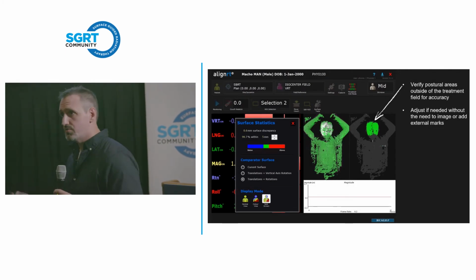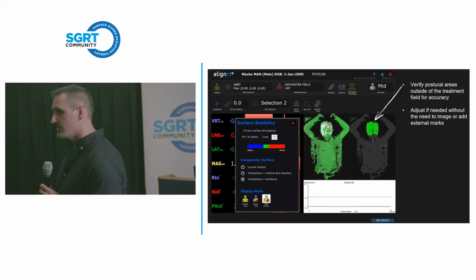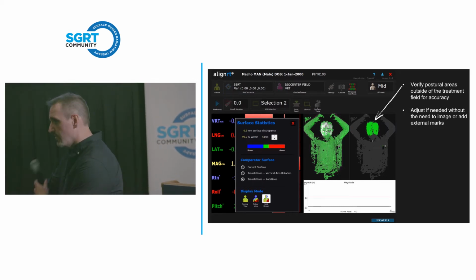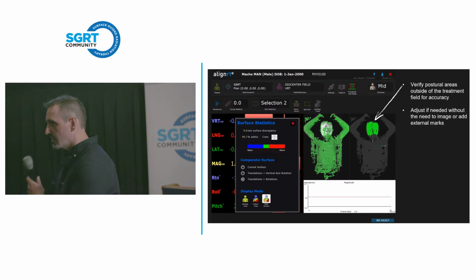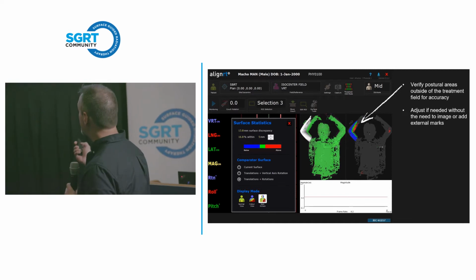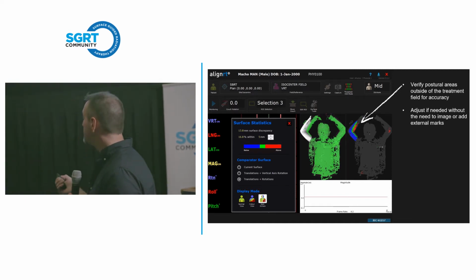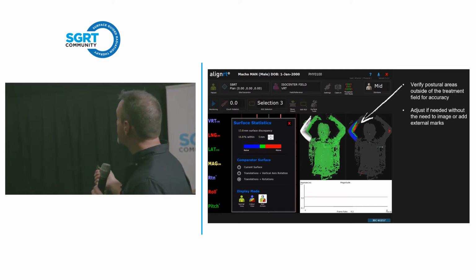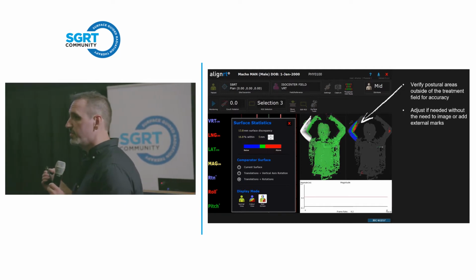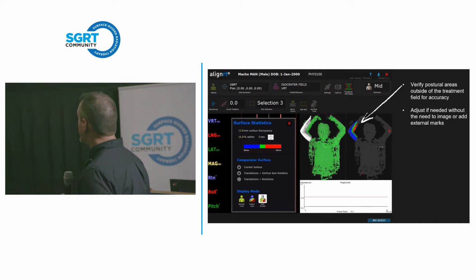All of this, again, is going back to what we would do. We've all had extremities where we have the 3 tattoos on the leg so that we have the right rotational tolerances and it's in the right position. You have the tattoo on the forearm here and here to make sure you have the correct bend of the arm. So we're all used to those things. So here's another one where one arm is correct, the other arm is incorrect. You can easily see that from the ROI and the green treatment surface, but you can also look at it from a heat map standpoint and ask, is this patient's posture in the right position? And so we can go ahead and correct those things.